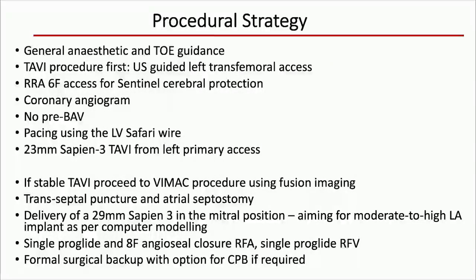Now, the procedural strategy that was eventually determined was that this case was going to be done under a general anaesthetic with TOE guidance. We were going to do a simultaneous case of a TAVI procedure first: ultrasound-guided left transfemoral access, followed by sentinel protection, coronary angiography, no balloon aortic valvuloplasty before the TAVI valve, and then a 23mm SAPIEN 3 TAVI valve deployment from the left primary access.